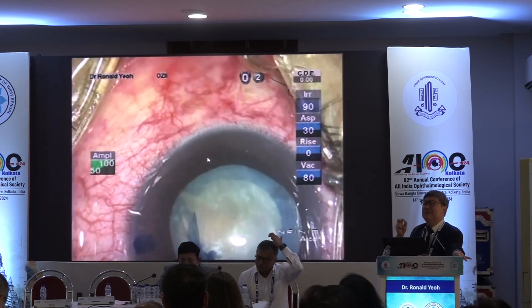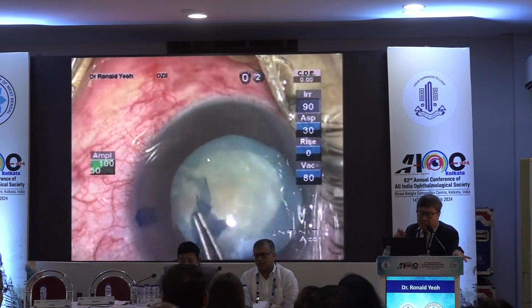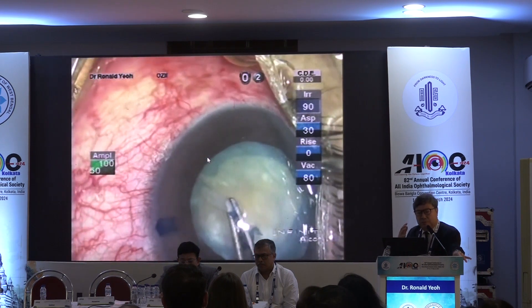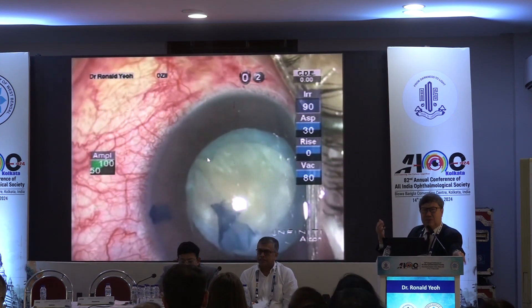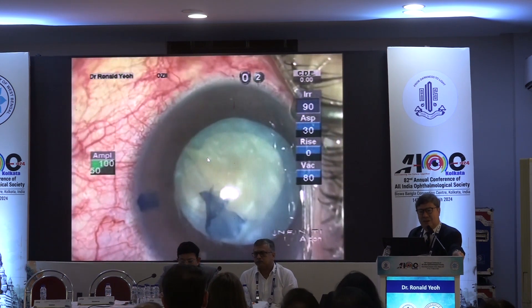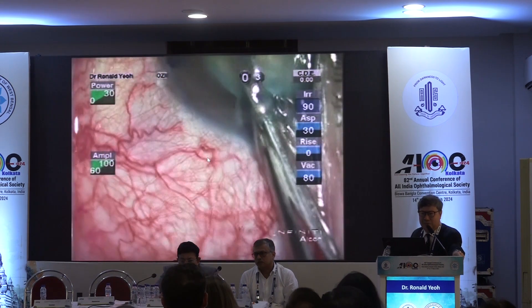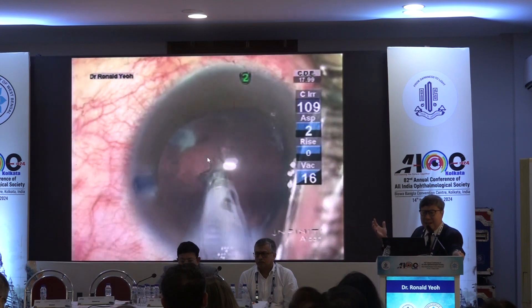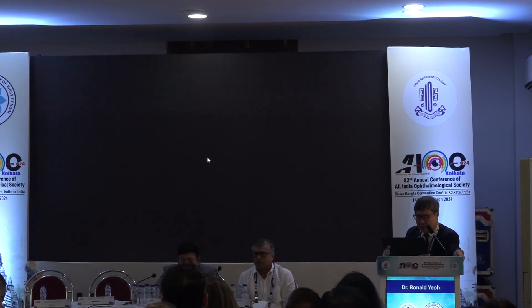So that last half a millimeter is a pain in the proverbial. When this is done, you have to adopt really very slow-motion phaco techniques to not make that anterior radial tear extend posteriorly. The message is: take your Vannas scissors out earlier rather than later. And finally, I do what I should have done at the very beginning — get my Vannas out to snip that offending band. And at the end of surgery, you see how thick that residual band is. No idea it was that bad when I started, because it was a white cataract.